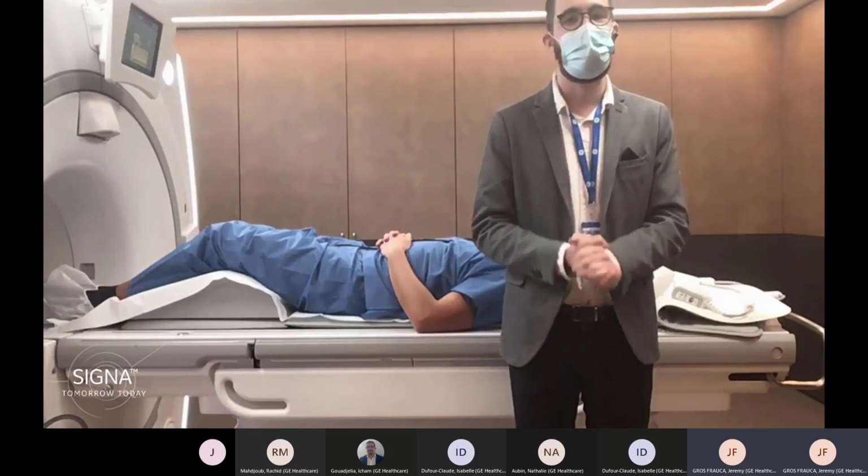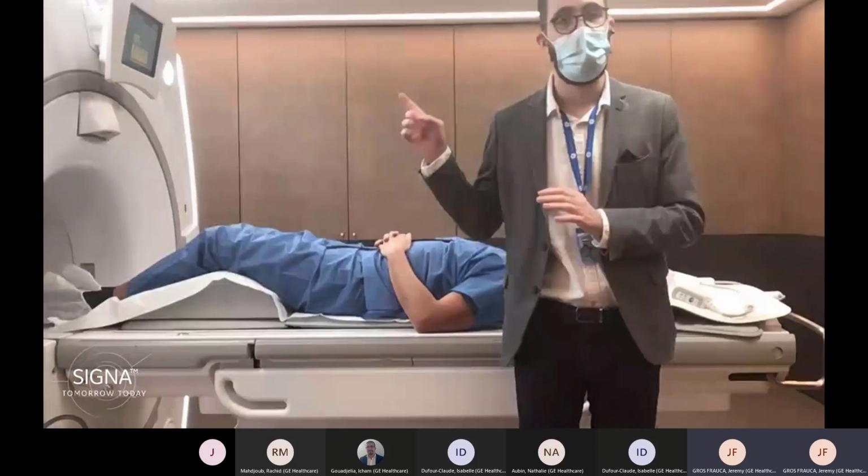I'm really happy today to welcome you this morning virtually in our Customer Center in Buc, and more specifically in the magnet room of our Customer Center. We have a SIGNA Architect installed, and we will use this system today for the live scanning session.